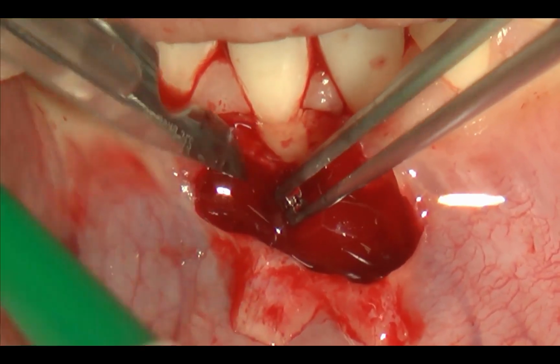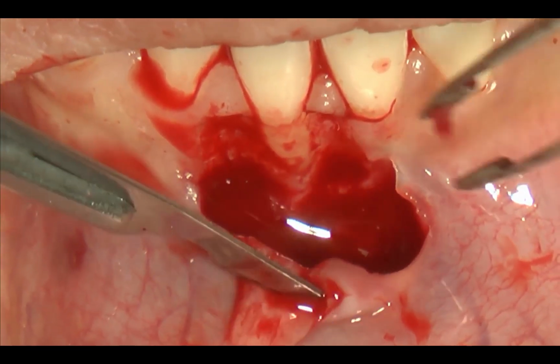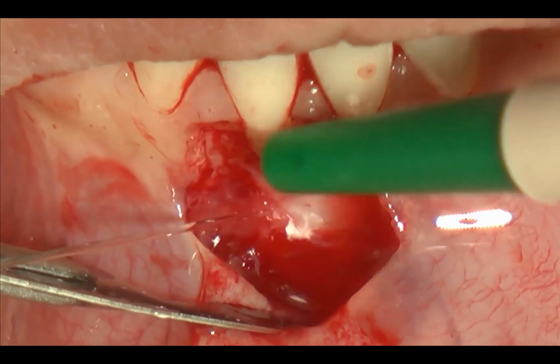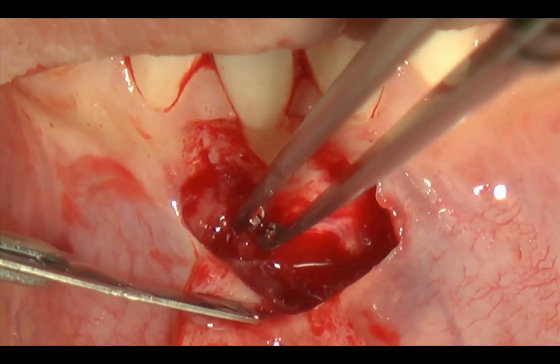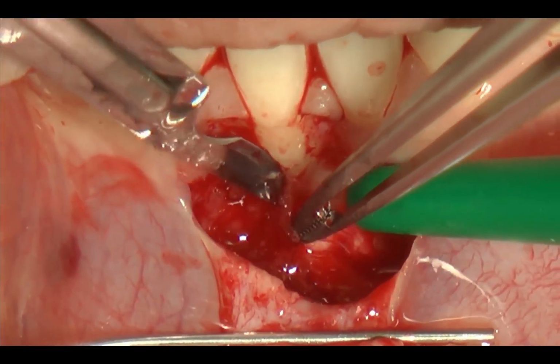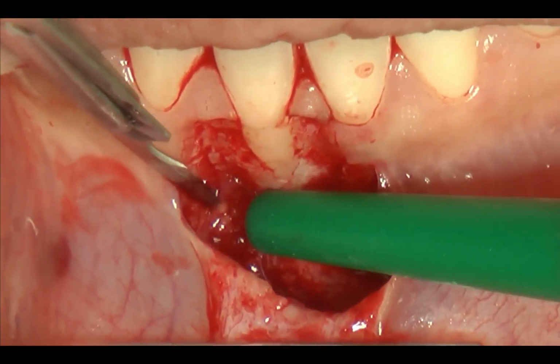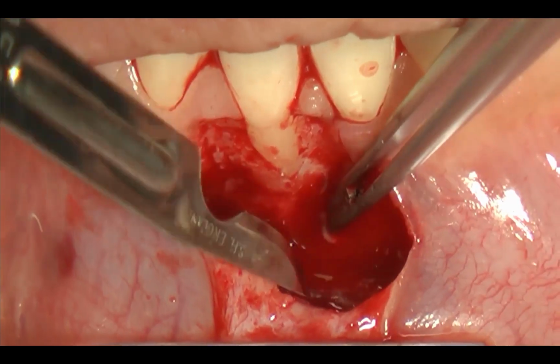There is no more fatty, glandular, and muscle tissue, vital physiological. And you should see very carefully that the whole area is periosteum only, and the whole submucosal tissue must be removed specifically from this area, not to have an early shrinkage of the flap once it will be repositioned coronally.